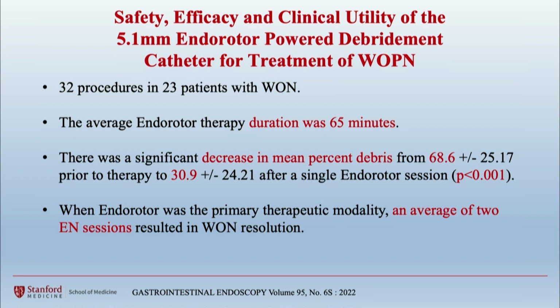And this is a study that included our center. It's still in abstract form. It included 23 patients with 32 procedures. Again, 50% of the necrosum was able to be cleared with one session. For those cases that had only the EndoRotor as a modality of intervention and clearing of the cavity, an average of 2 sessions were required to complete the debridement.